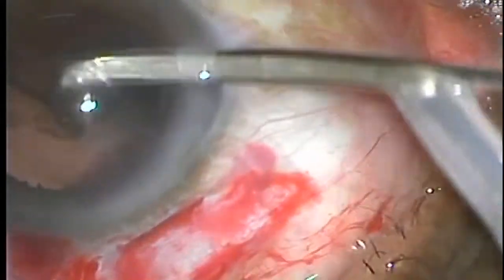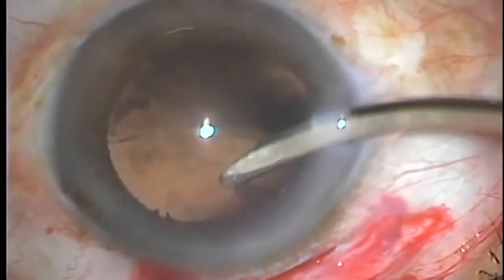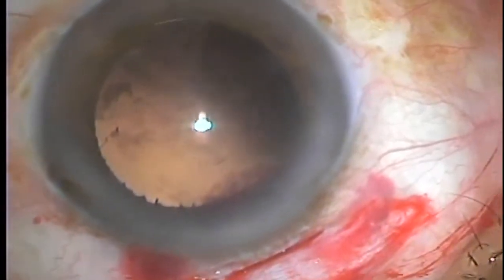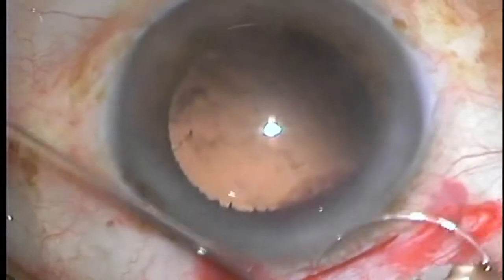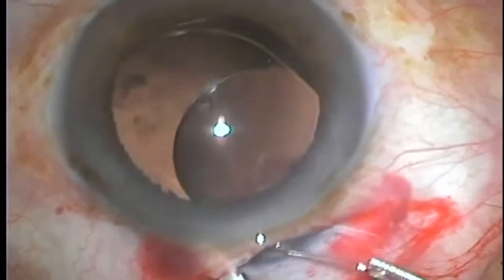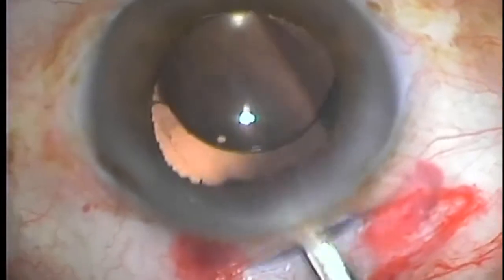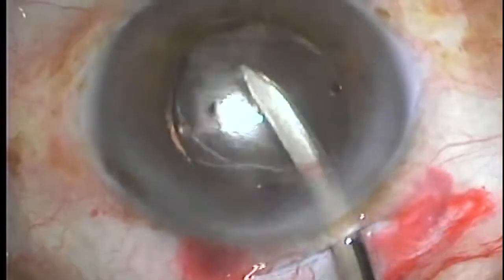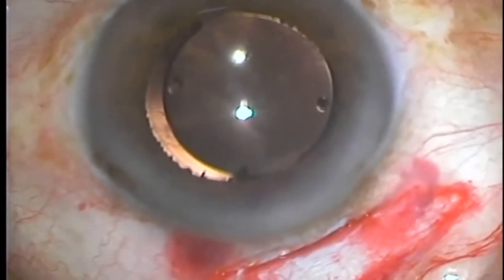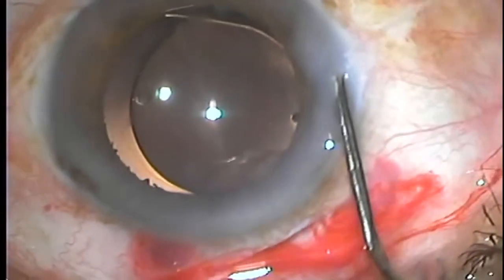Once the cortex has been aspirated out, the next step is to place the intraocular lens inside the bag. With a good view of the capsular margin, the lens is inserted under hydroimplantation by keeping the simco at the edge of the sclerocorneal tunnel and pushing the lens in. The leading haptic goes inside the bag first, and then the trailing haptic is dialed inside. The IOL is now inside the bag and the side ports are hydrated.